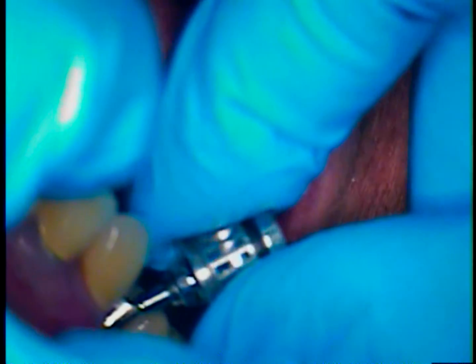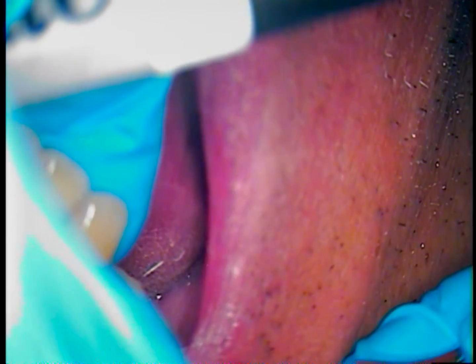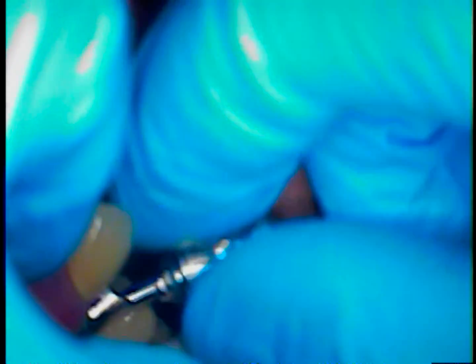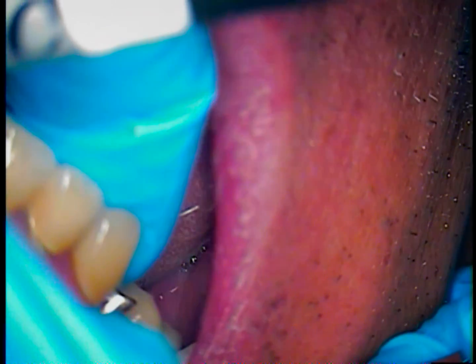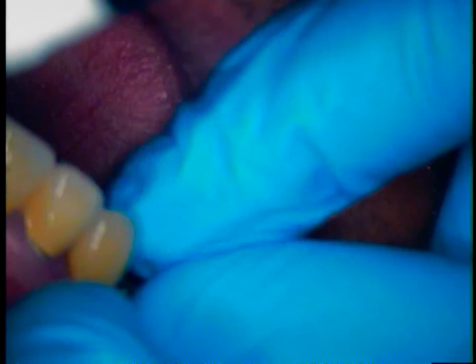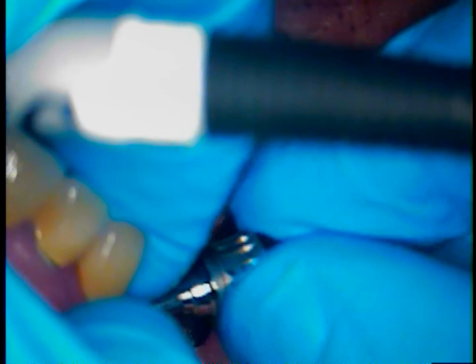Now I'm hand tightening, making sure it's down. Since there are six sides to the hex, there could be a position that may appear to be right, or maybe it might not. So you have the ability to move it — I'm unscrewing again to see if I can reposition it. This is all just gentle — no torquing yet. I'll take that abutment and see if I can reinsert it. It feels like the original setting is the right setting.